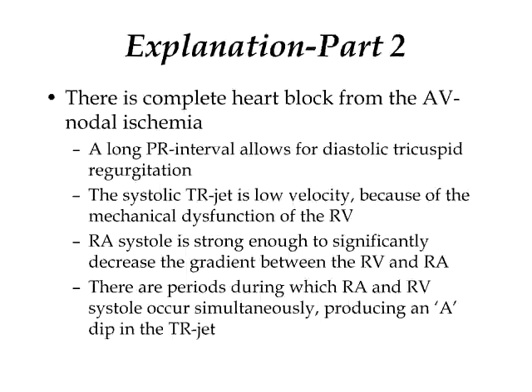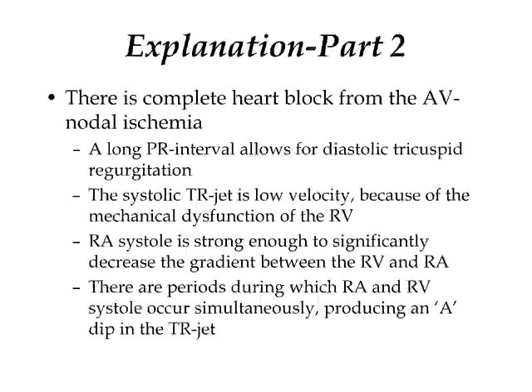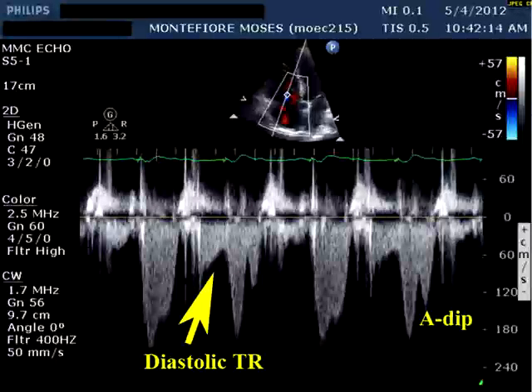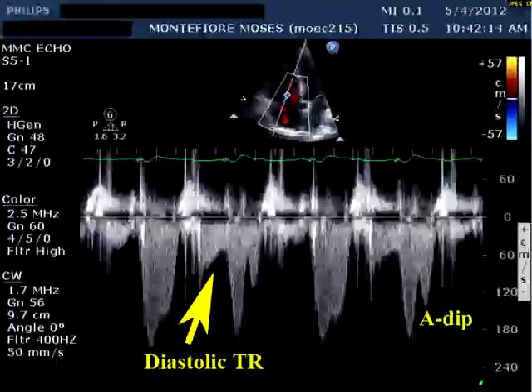Sometimes RA systole is occurring at the same time as RV systole because of the complete heart block. When that happens, RA pressure increases, thereby decreasing the gradient from the right ventricle to the right atrium and giving that notch — what I call an 'A dip' or atrial dip — in the TR signal. Looking at the Doppler signal, the systolic TR signals all have little notches in different places corresponding to those periods where RV systole and RA systole are happening simultaneously.